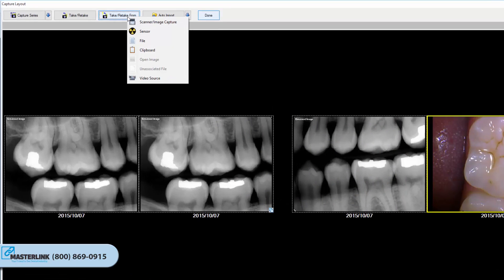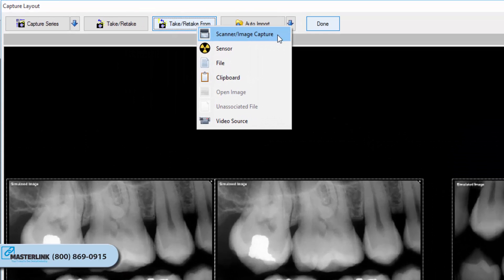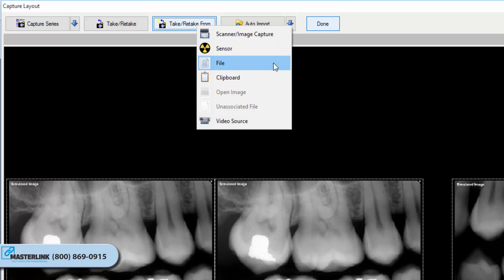Here are the different Take Retake From choices. Scanner Image: the software will prepare to capture from an imaging device extension, flatbed scanner, or other Twain-enabled device. Sensor: the software will prepare to capture from a digital x-ray sensor. File: the software will prepare to import images from the local hard drive, network, or media device attached to the computer. Clipboard: the software will prepare to acquire an image stored in the computer's memory via the copy function.